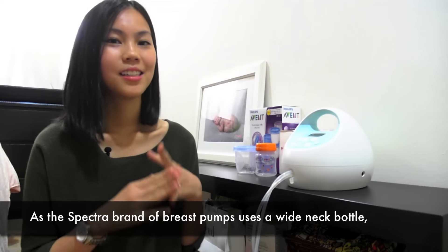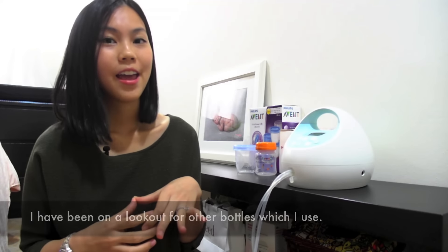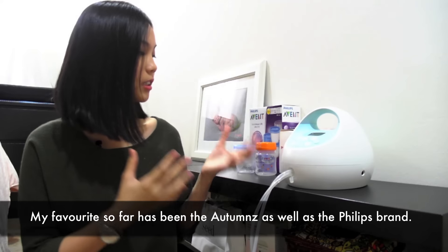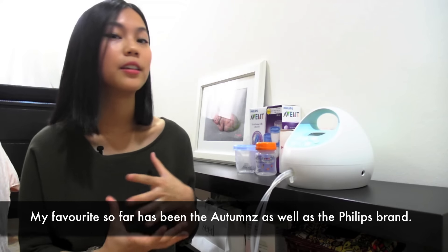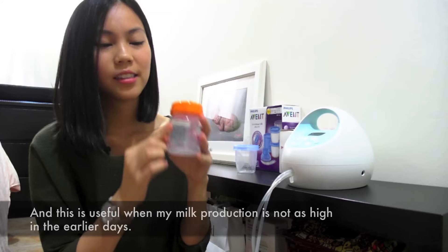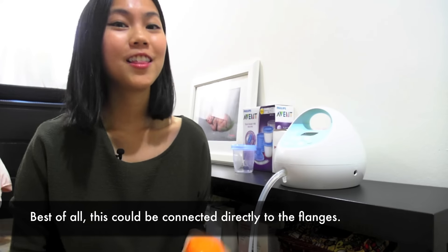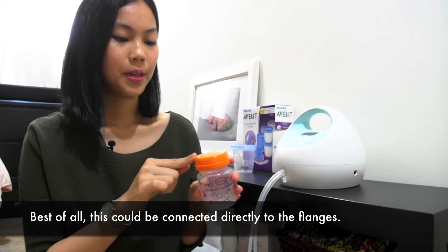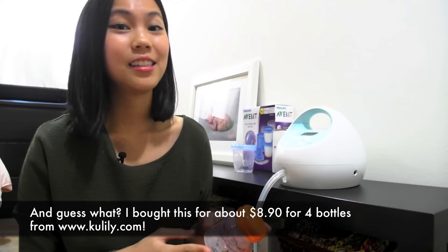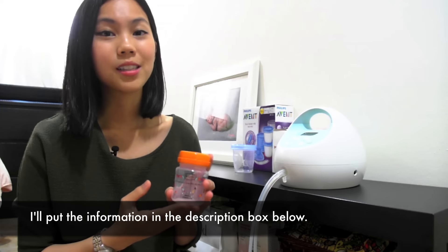As the Spectra brand of breast pumps uses a wide neck bottle, I have been on the lookout for other bottles which I use. My favourite so far has been the Autumnz as well as the Philips brand. The Autumnz come all the way up to 120ml, which is useful when my milk production is not as high in the earlier days. Best of all, these can be connected directly to the flanges — and I bought these for about $8.90 for four bottles from Koolily.com.